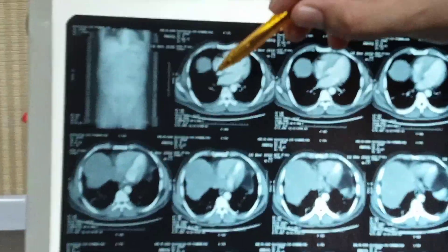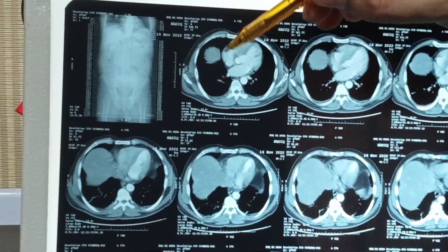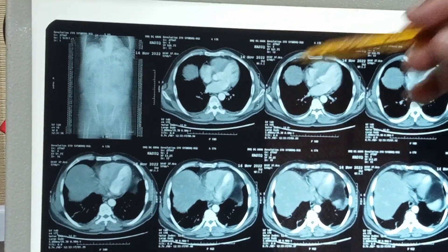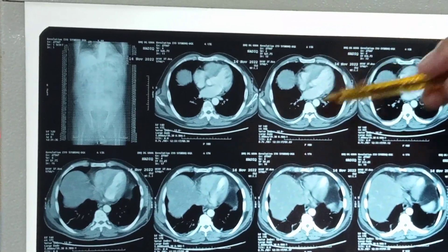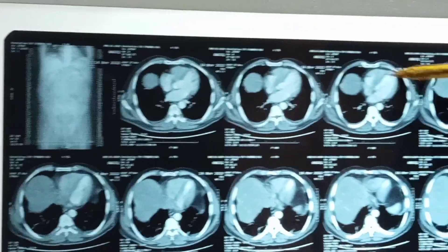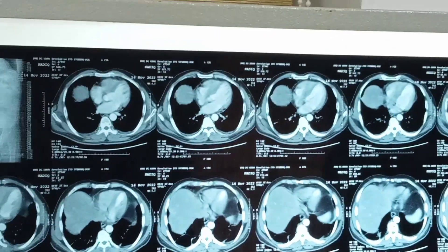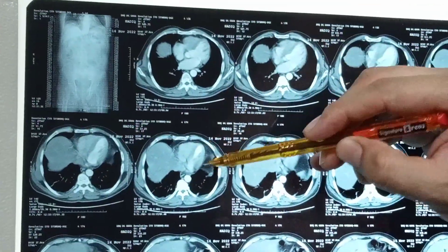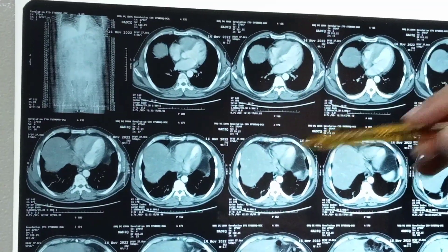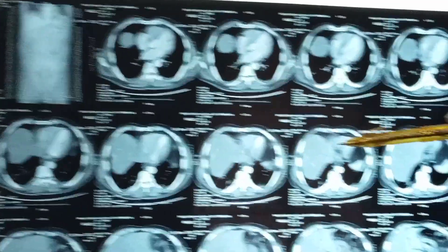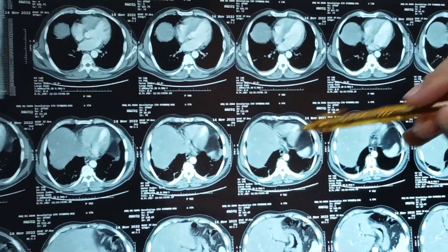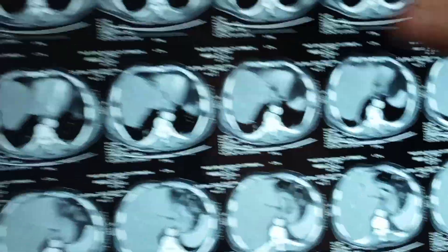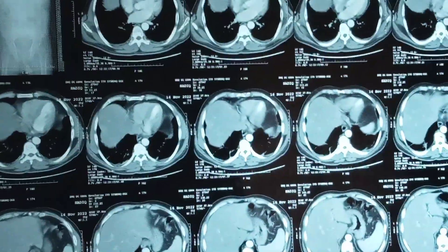This area is known as the mediastinum. Here, the heart and the large blood vessels are there — this whole area. I am going to mark and point this area. Can you visualize this? You can zoom. Now, the mediastinum has ended.